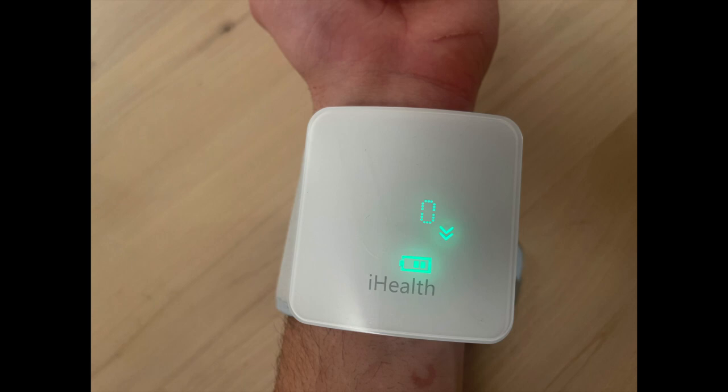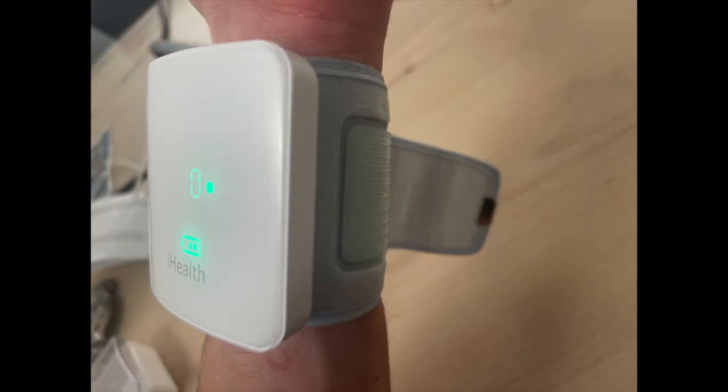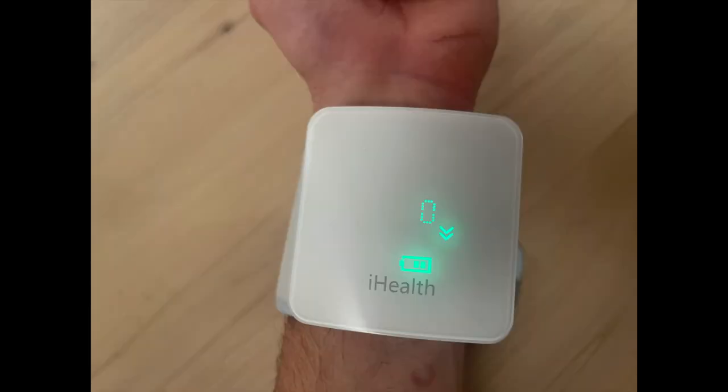For placement, undo the Velcro on the cuff and place it around your wrist with your palm up, with the iHealth text logo visible on the bottom side of the display, facing and readable by you. The cuff should rest 1 to 2 centimeters below your palm and square. Ensure the Velcro is tightened snugly but comfortably. Once the device is properly placed on your arm, you're ready to take a measurement.